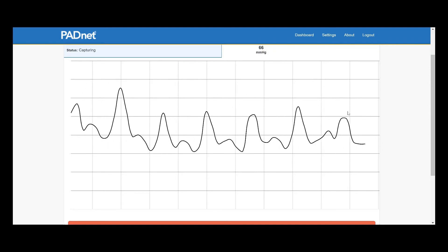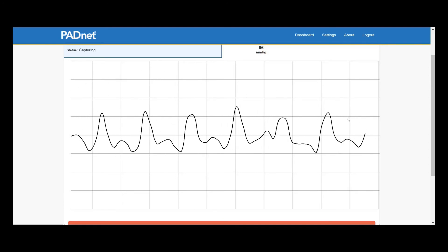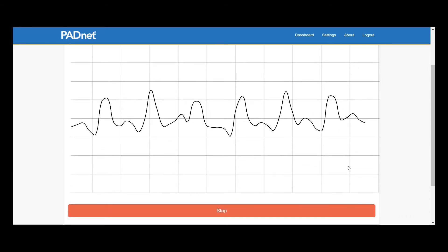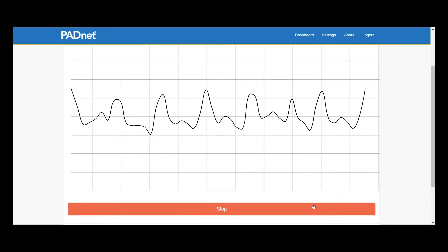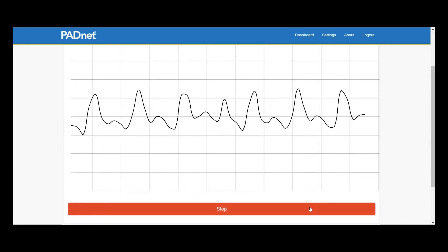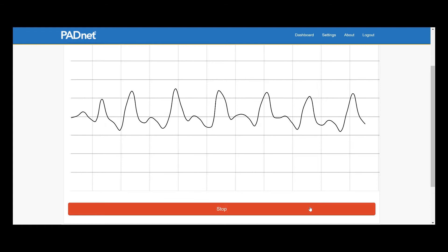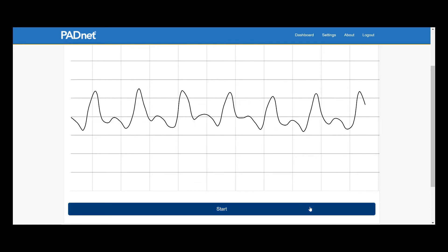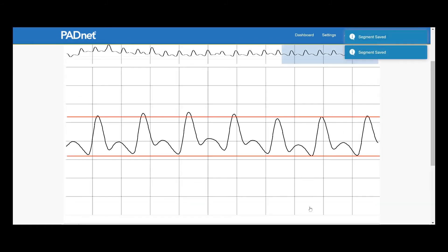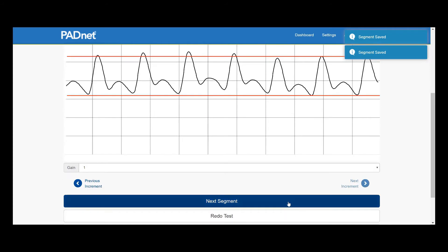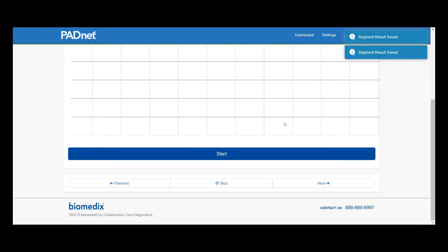For a solid PVR interpretation, we want at least three waves that look near identical to each other. I like to let the test run a little bit longer because we can always go back. Once we're happy with our segment, we can go ahead and click Next Segment.